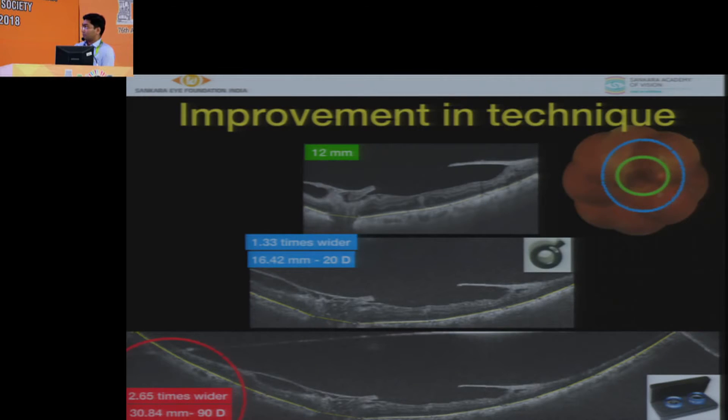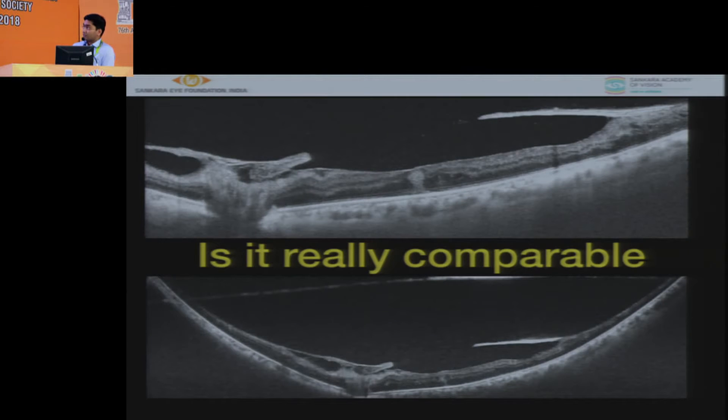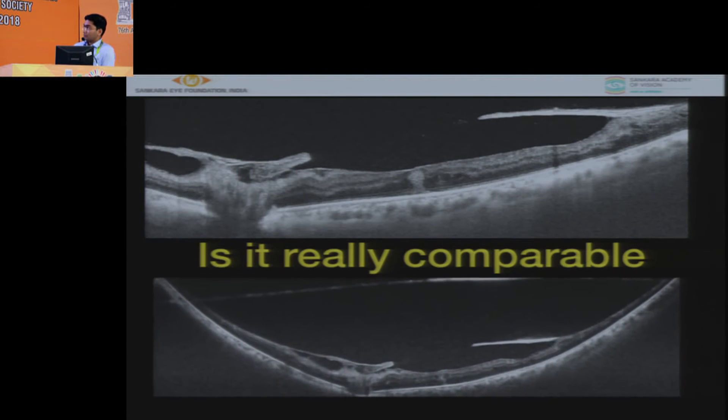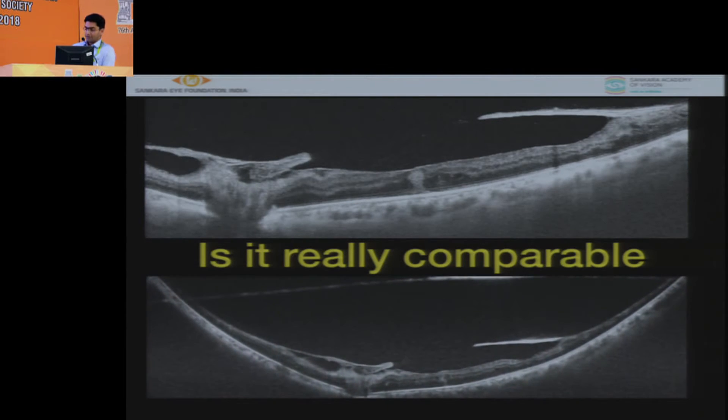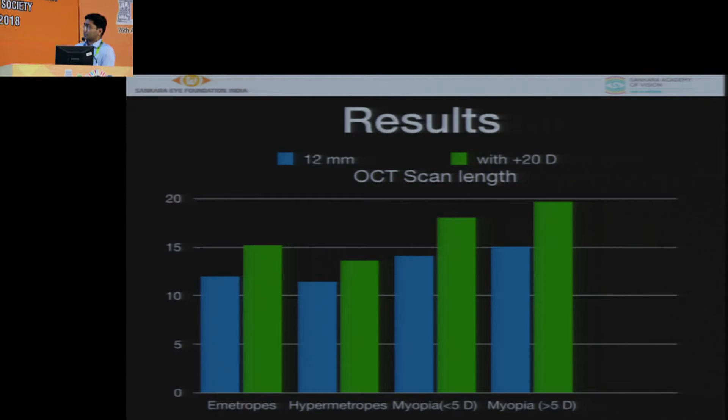As you can see is it really comparable? Yes the quality is as good as what you see over there. This result shows that emmetropes versus hypermetropes versus myopes of less than 5 and more than 5 - all of them show that using 20-diopter has a wider field of view, widest in the high-myopes.